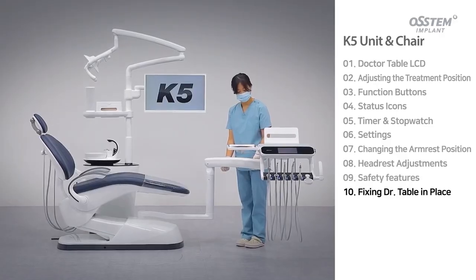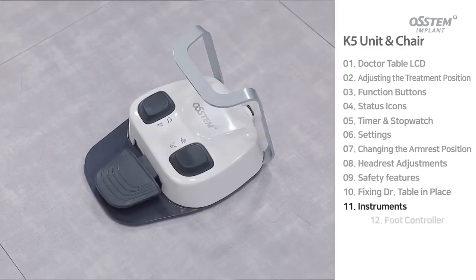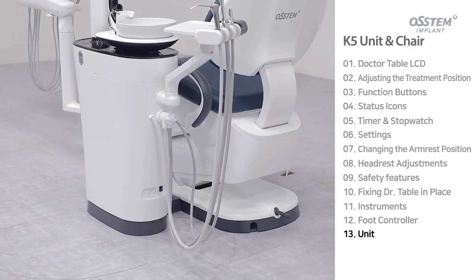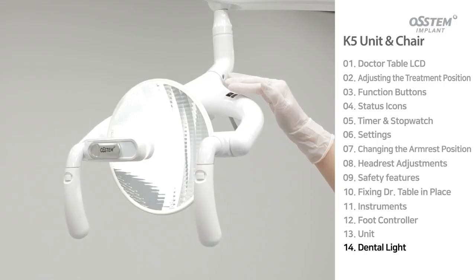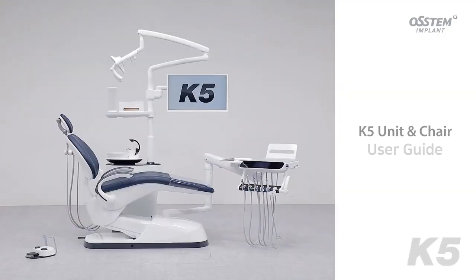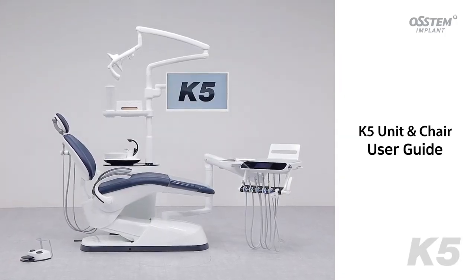10th, fixing doctor table in place. 11th, instruments. 12th, foot controller. 13th, unit. 14th, dental light. Finally, Honero console. Now, let's go over each part of the K5 step by step.